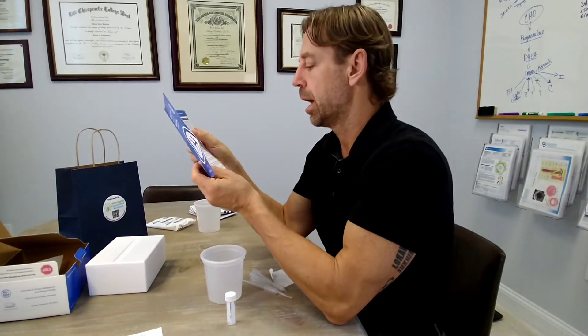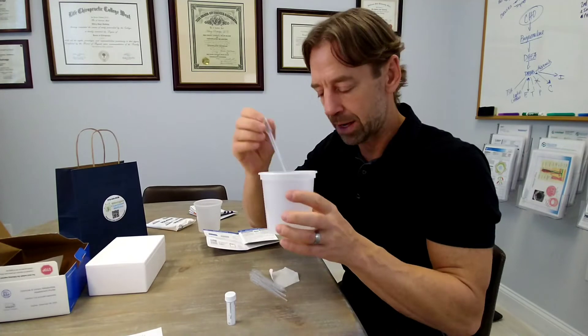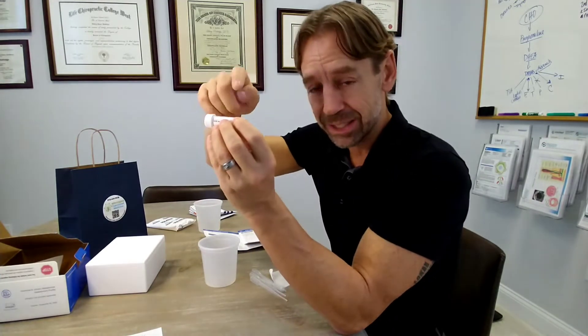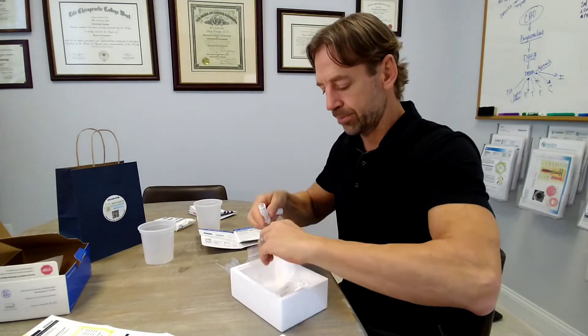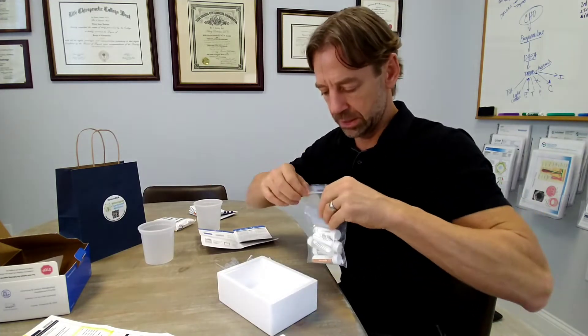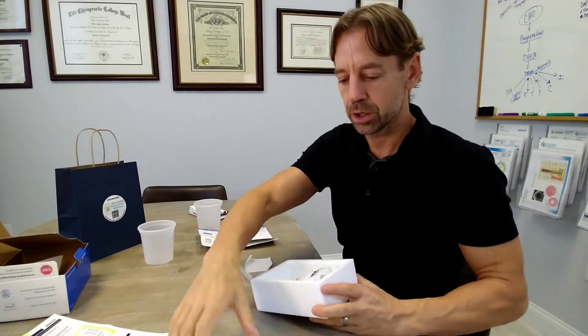The last sample is the green tube, collected two to three hours after waking. So if you wake up at 8 AM, this would be around 10 AM. Same process: clean cup, pee in it, pipette into the green tube, fill to the fill line, and make sure you fill out your name and the exact time on the tube. This is your final sample. Seal the Ziploc bag, put it into the styrofoam box, place the ice pack on top, and close the box.